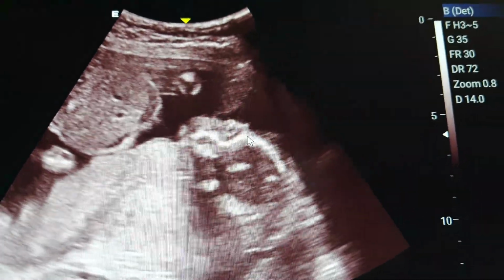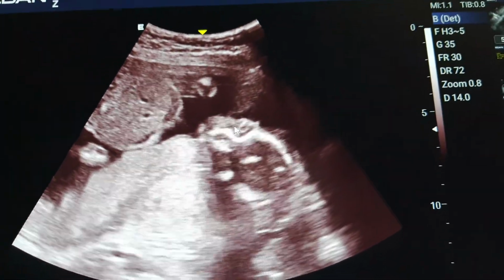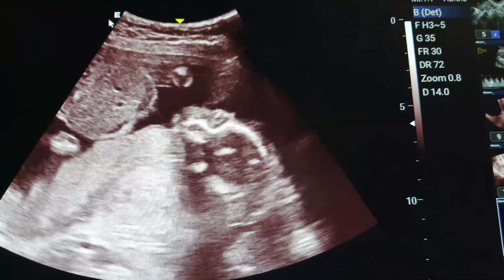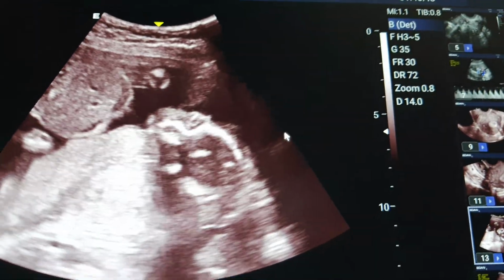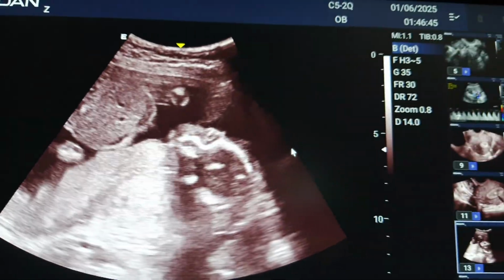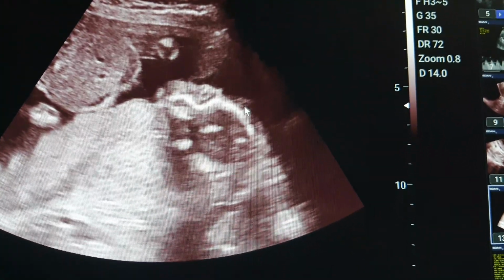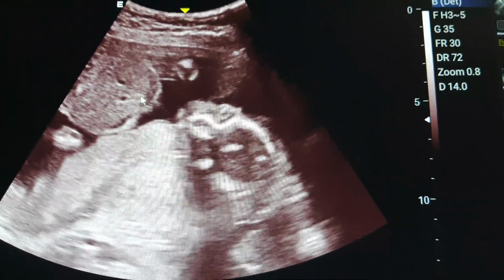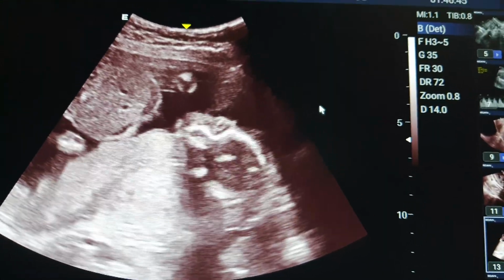Please remember that when I'm looking at this screen, there is a landmark here, and that landmark is very important because it should be in the same direction as the probe you're using in the longitudinal section. If you are using the probe longitudinally, suprapubic, and you can see the fetal head suprapubic on the mother, you should imagine that the lady's head is towards this side and her legs towards this side.